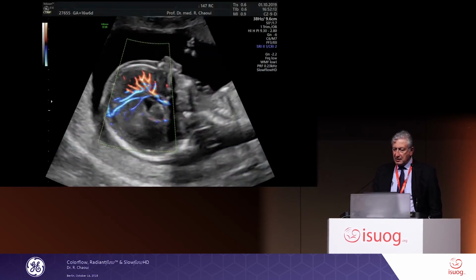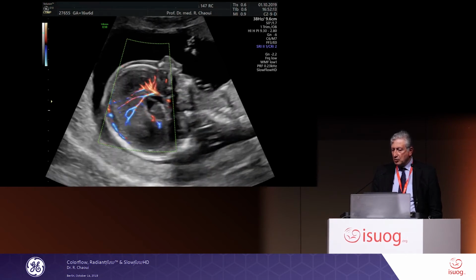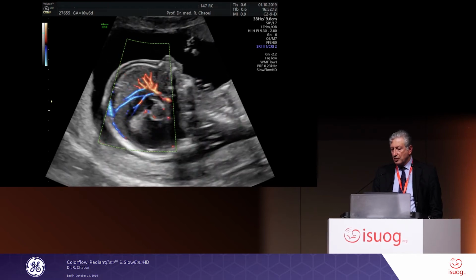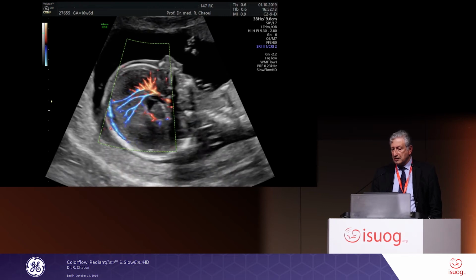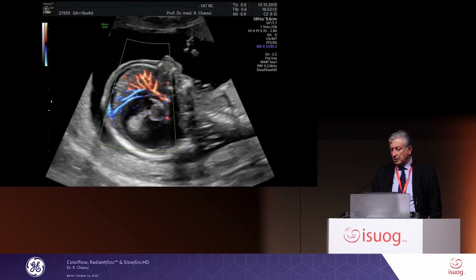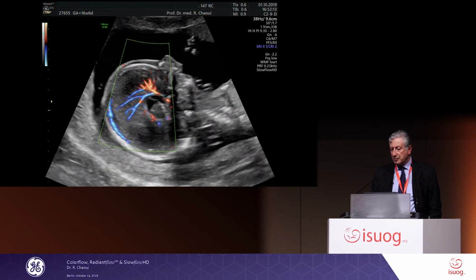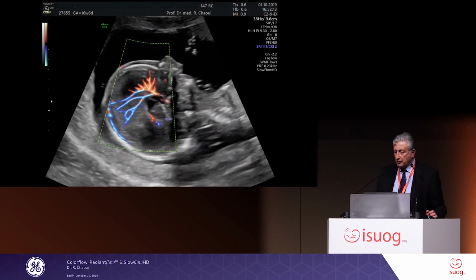And then see this fetus at 16 weeks with a suspicious face, and the brain looked like a Warburg syndrome, and look at these abnormal vessels. And please note the horizontal course of this vessel, showing that even when there is horizontal course with slow flow, you are able to demonstrate and see these things. And this is here for me typical in a complete agenesis of corpus callosum, because there is no typical C shape we see also at 16 weeks, as I showed you before.